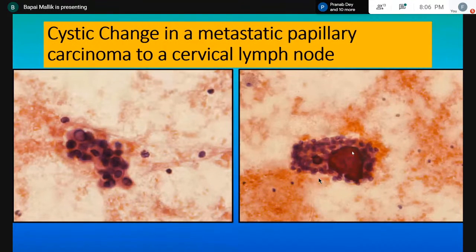I've seen a few of them where you get a lymph node which is far removed from the thyroid. You put a needle inside and what you aspirate is dark, altered blood. You think, am I dealing with some kind of a hematoma or some other kind of hemorrhagic lesion? And you make the smears, and like 99% of the smear is made up of blood.